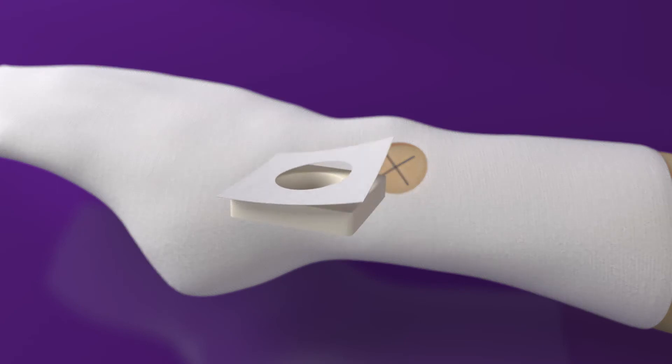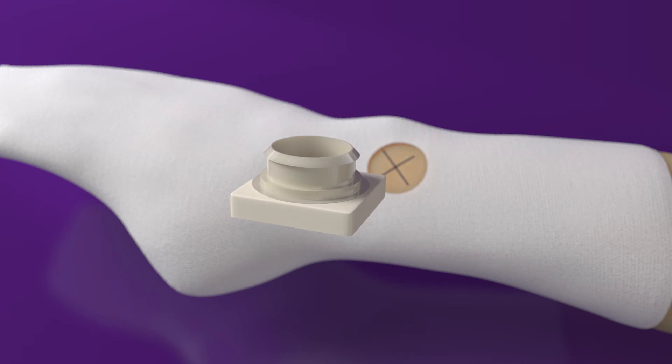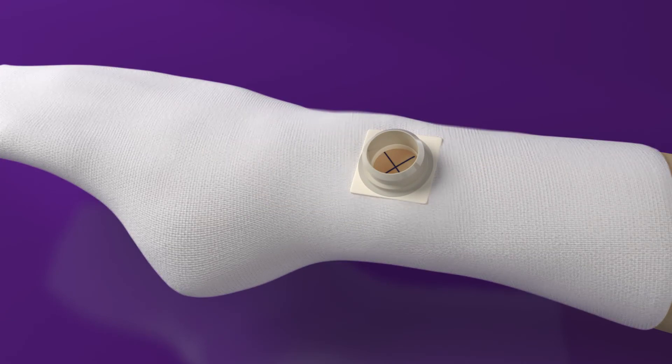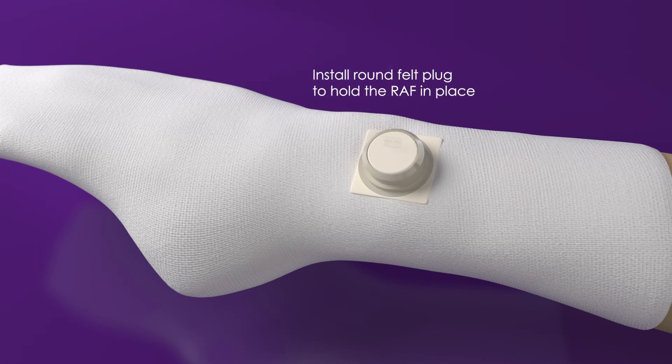Peel off the adhesive backing from the off-white square pad and stick to the bottom of the RAF. Then insert the assembly into the stockinette. This is what correct placement of the assembly should look like. Putting the felt plug in place will hold the RAF aligned.